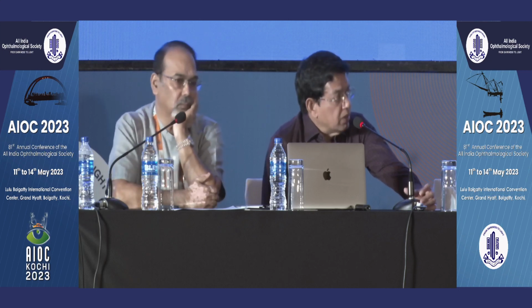One of the questions that's often asked is, yes, the cutoff according to the company was 3 millimeters earlier. Now they have dropped it down to 2.8 millimeters. What if the AC depth is 2.65 or 2.7? Is there a lower cutoff? Can you go ahead and implant in those cases? Would you like to clarify on that?